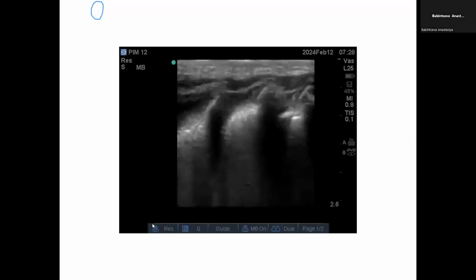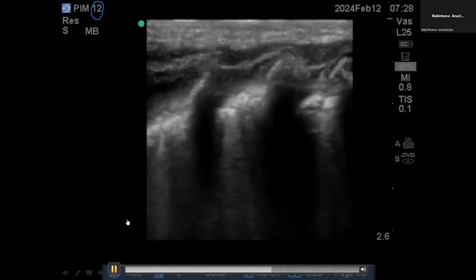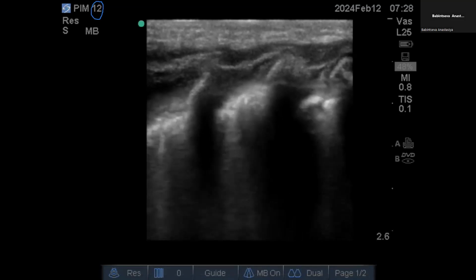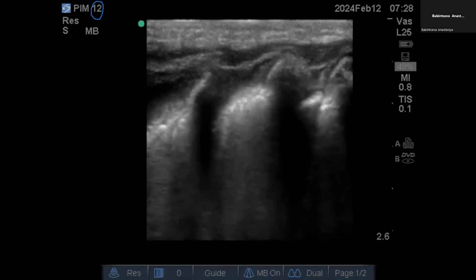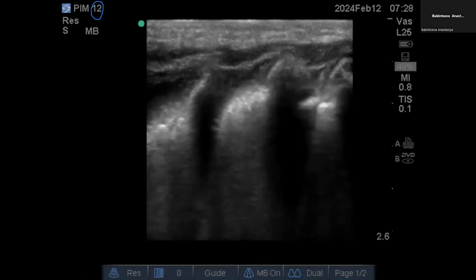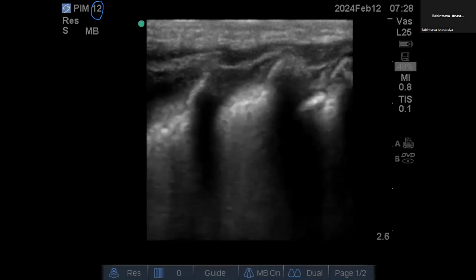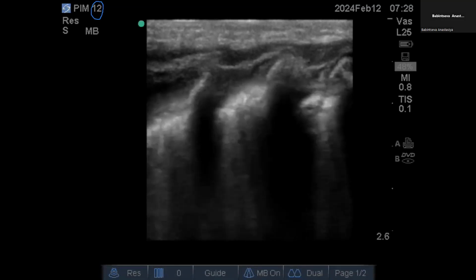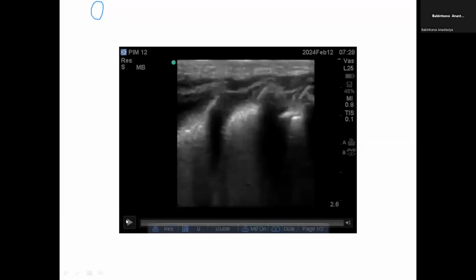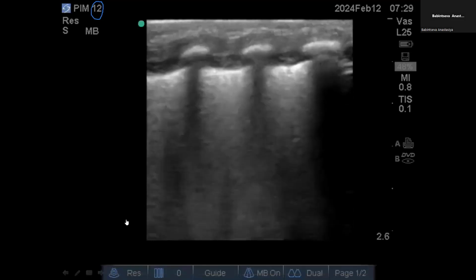this one here, I'm a little bit concerned that especially in this region you're starting to see atelectasis now. This is R1 anterior. The probe should be perpendicular. Zoom out. And I think once you start seeing atelectasis, and if we had a slightly wider vision, I'm sure you'd see more atelectasis. So this just hits 3 for me at this stage, especially this region over here. This will be a 3. This would be a 2 for me. But here, this is the third.